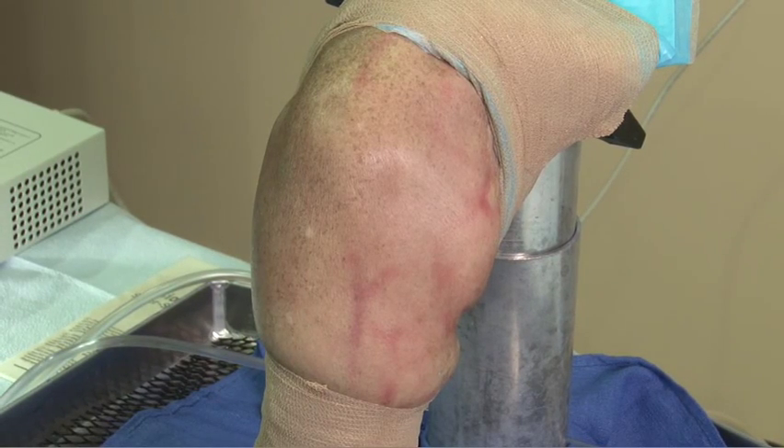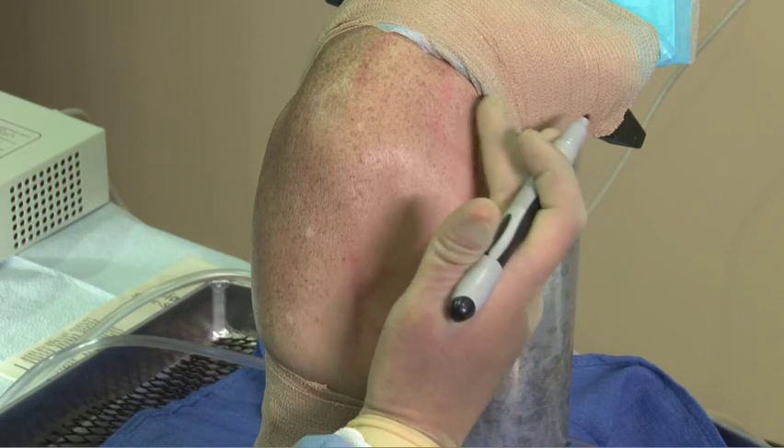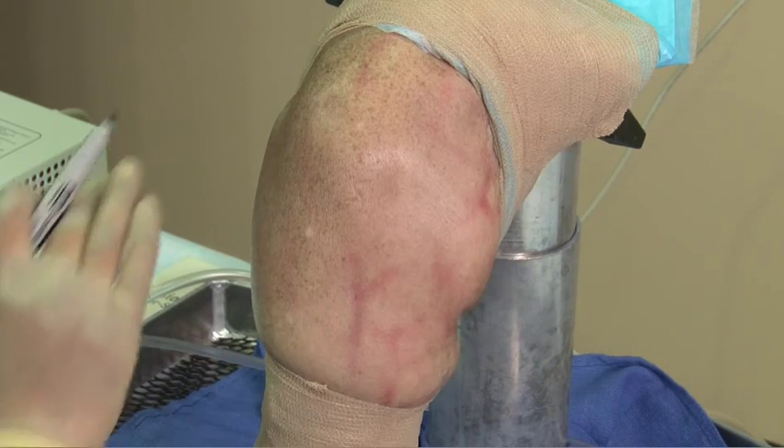This is a right shoulder view, demonstrating the anterior part of the shoulder and the posterior part of the shoulder.